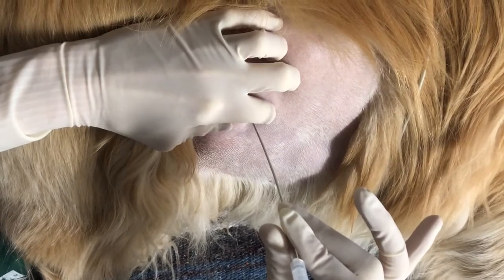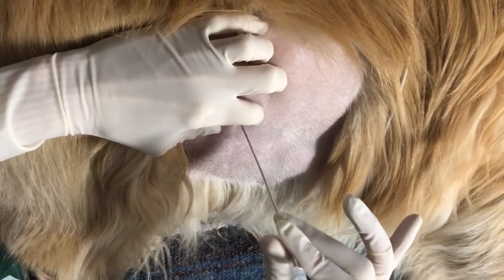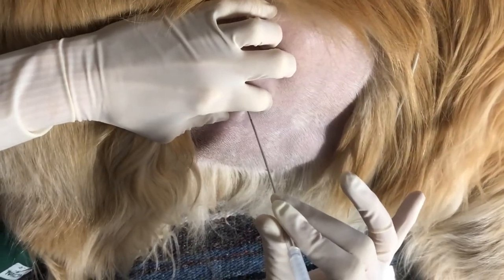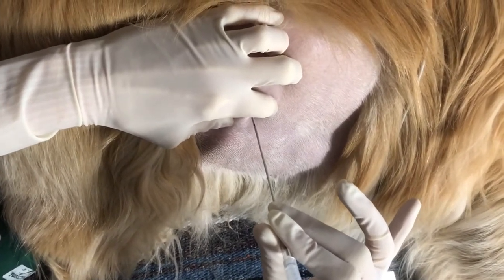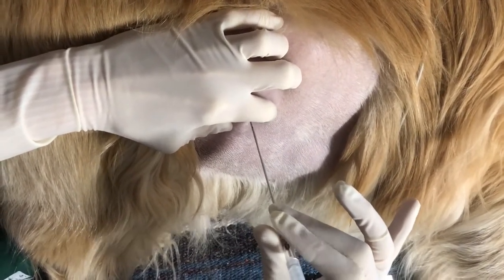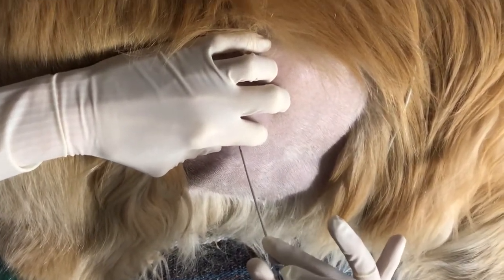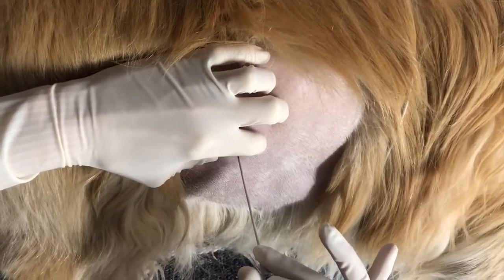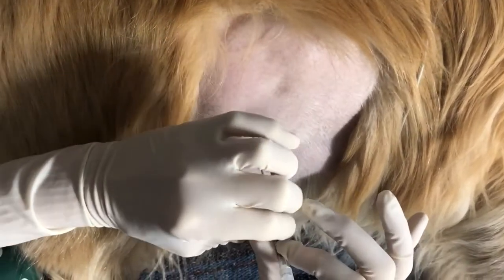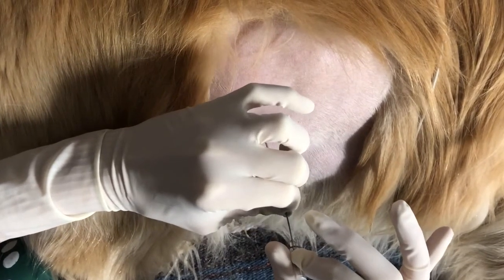As your stylet encounters the pericardial sac, you may feel a small amount of resistance or subtle movement. As you penetrate the pericardium, you feel a gentle pop, like you sometimes feel when you enter a vein. When you enter the pericardial sac, you will see a flash in the hub of your catheter. At this point, advance the stylet and catheter together a couple millimeters, then holding the stylet still, feed the catheter off the stylet the same way that you would when feeding a catheter into a vein.